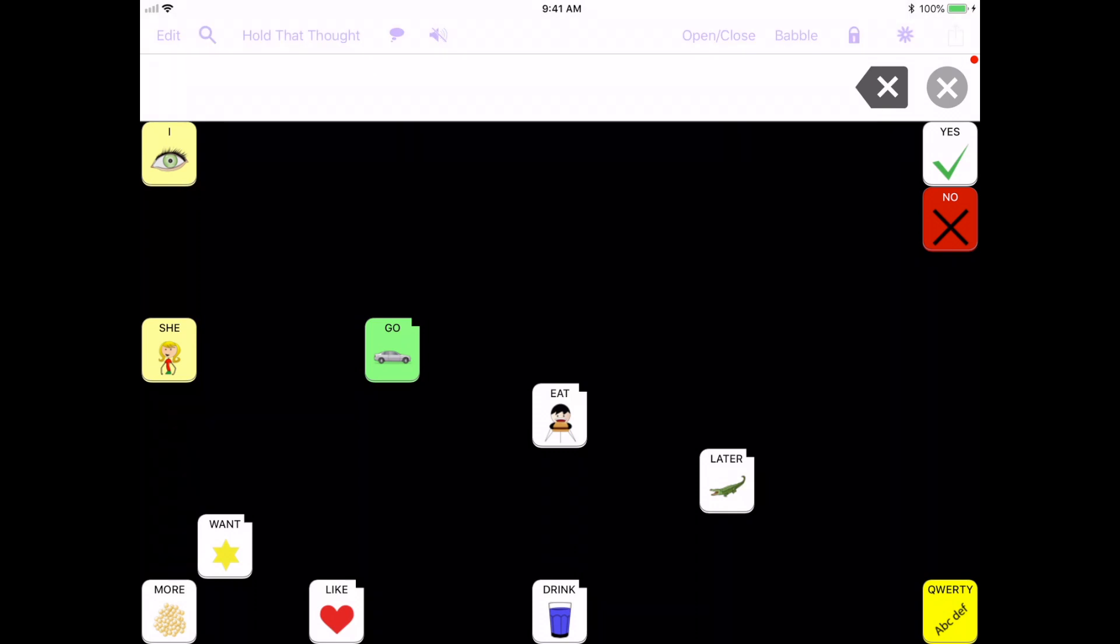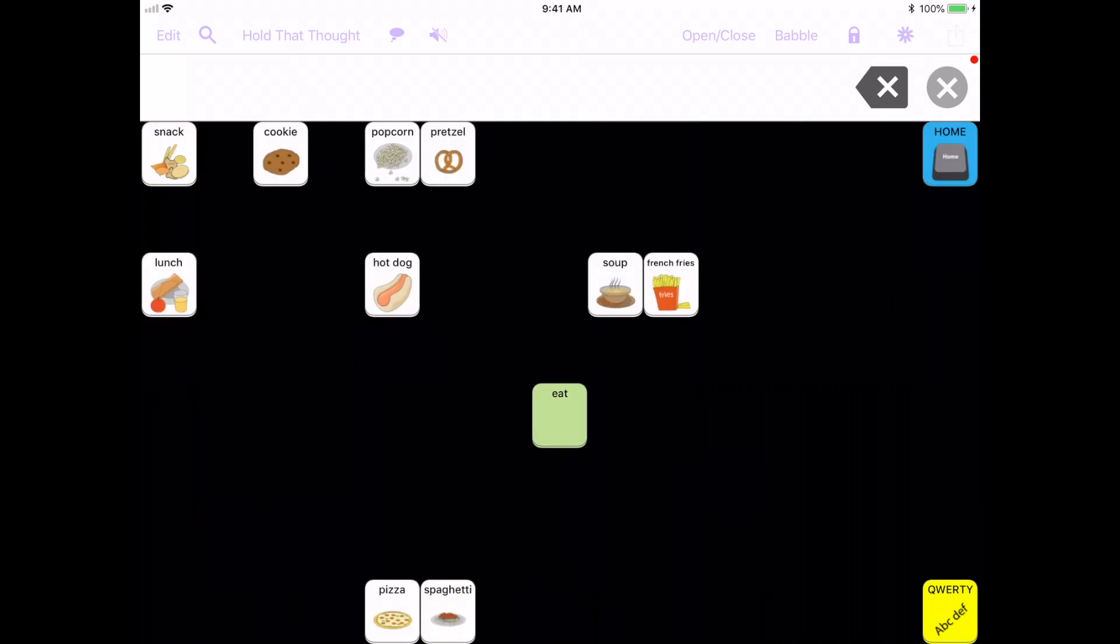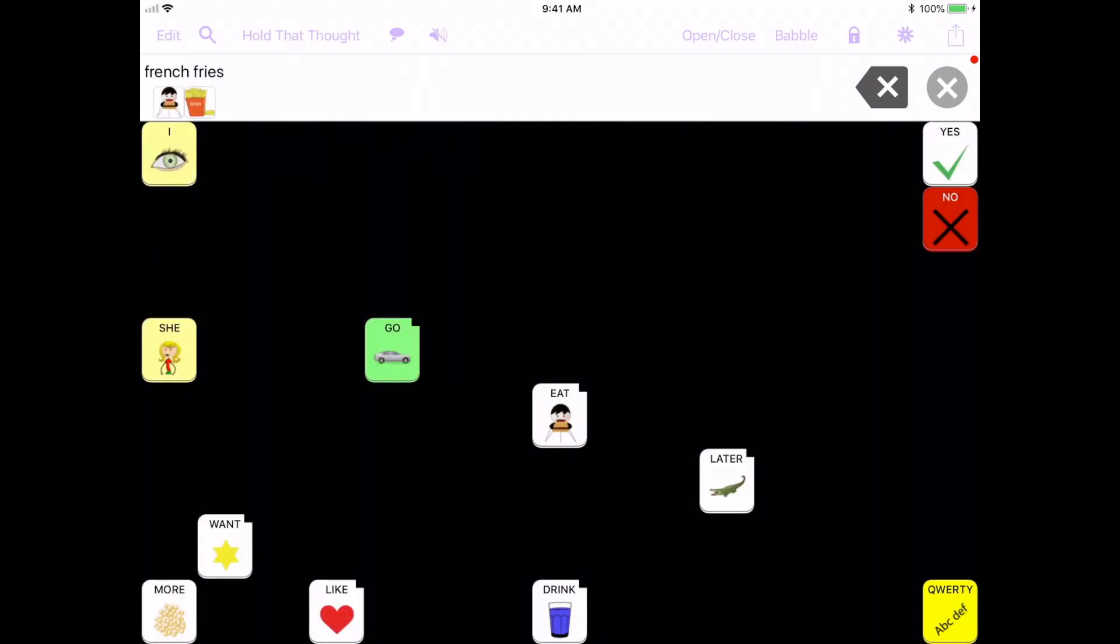So it kind of gives you that little prompt. So if you're working with a student and it seems like the iPad's a little bit delayed, they may have touch accommodations on. Now in order to do it when I want to touch eat I have to put my finger there and hold it. So I really have to place my finger on that and hold it down a little bit. So it really does help if a child is really having a hard time where they're activating buttons by accident.